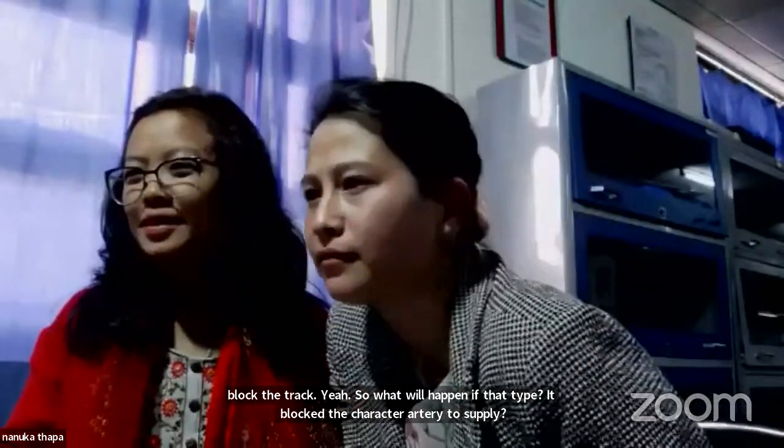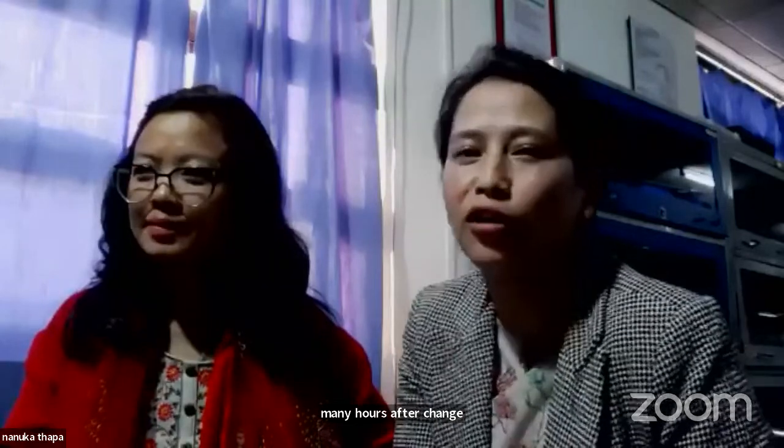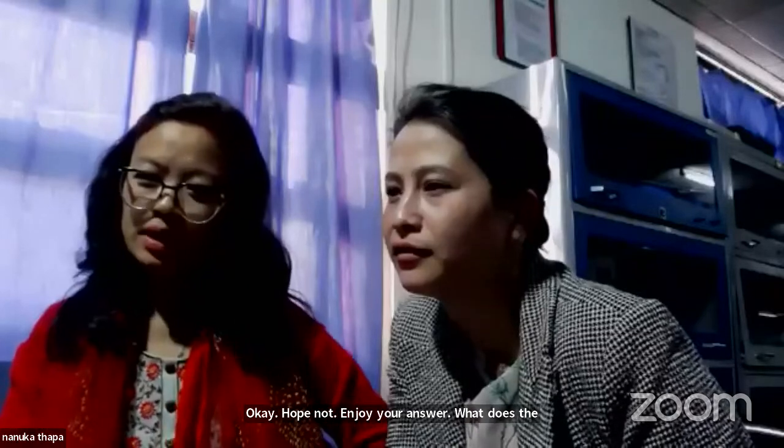Okay, next question: how many hours after should we change the tracheostomy tube dressings? We have to change it every shift, like 8 hourly. Hope Narendra, you got your answer. What is the rate of infection in both ET tube and tracheostomy?